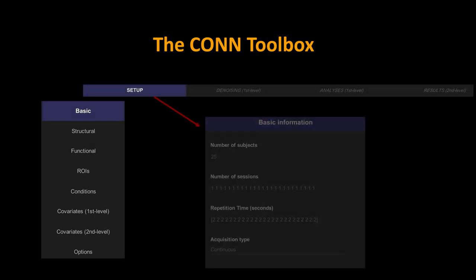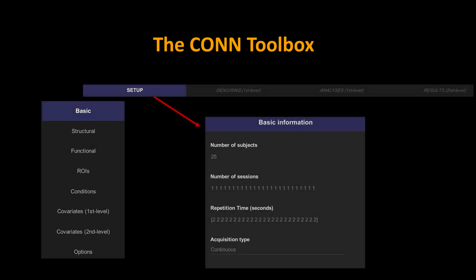The basic layout of CONN is pretty simple. Along the top ribbon you'll see different tabs: Setup, Denoising, Analyses, and Results. Within each of those you have a different menu on the left-hand side. Setup is where you enter all your basic information about repetition time, sessions, number of subjects, continuous versus sparse, and so on.